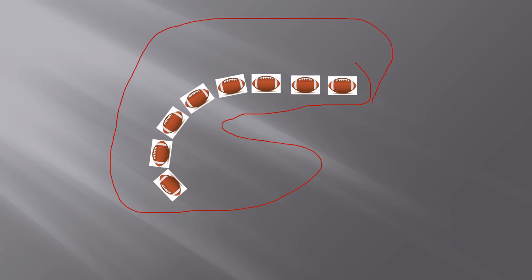This would be a demonstration of an arcuate fasciculus going from the frontal lobe down into the temporal lobe, and the software would follow from voxel to voxel the directionality. And if they're not turning too much, it would then connect them up. So you put in a parameter, look at everything that's similar to within 45 degrees or something like that, maybe 20 degrees. You can vary it and see the differences in your white matter tracts.